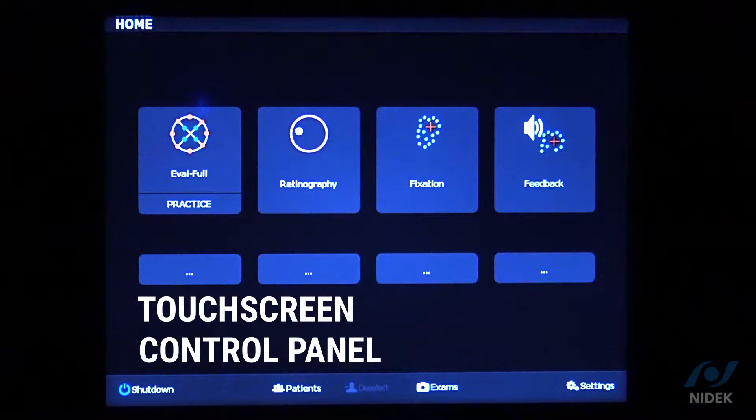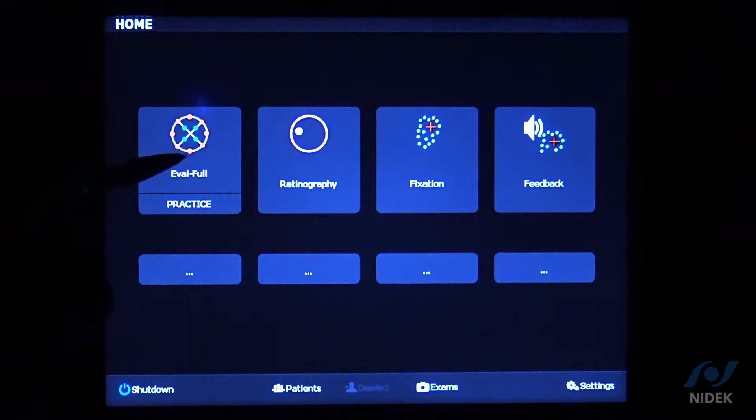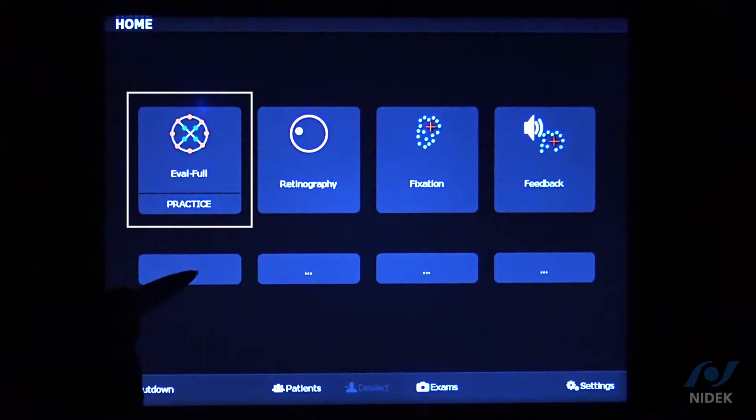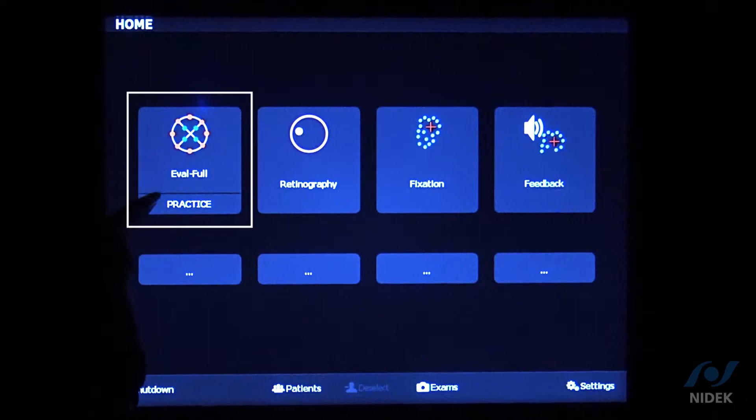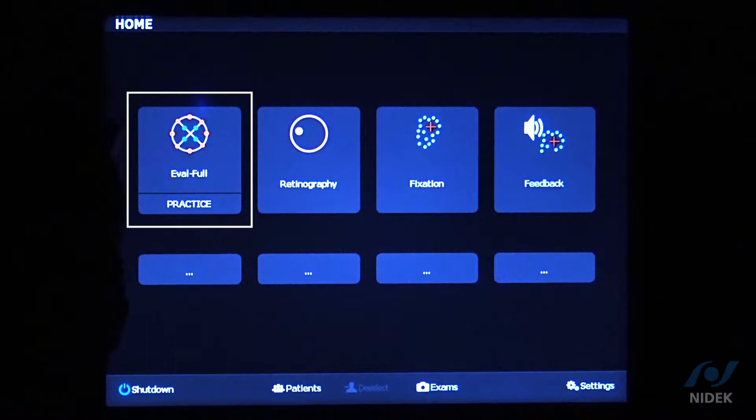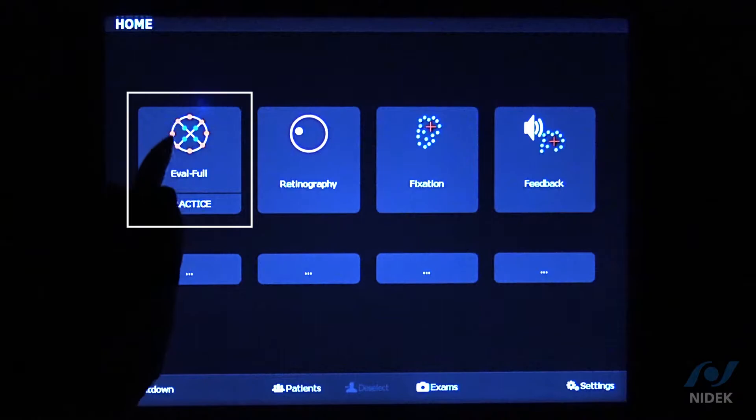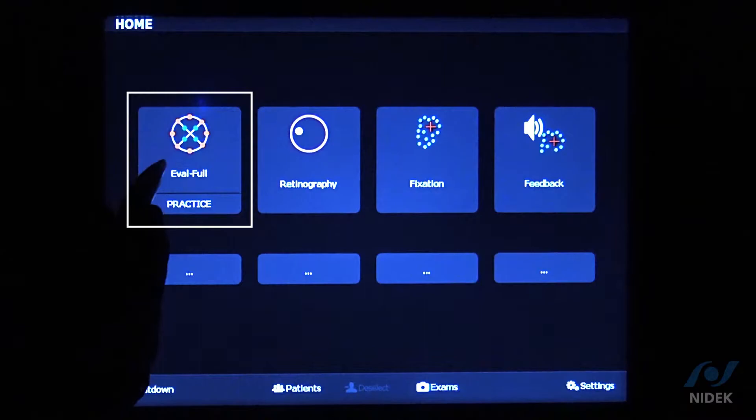I'm going to show you the MP3 touchscreen control panel. We have four icons. Within the microperimetry tab, once I select a pattern to start the exam, or if I go to my default pattern in microperimetry, you're going to get the fixation analysis, the patient's visual field or microperimetry exam and sensitivity level, and we'll also take a color fundus photo at the end.